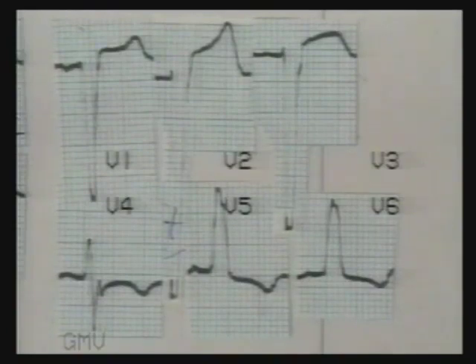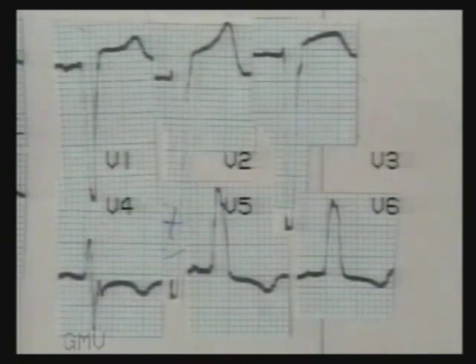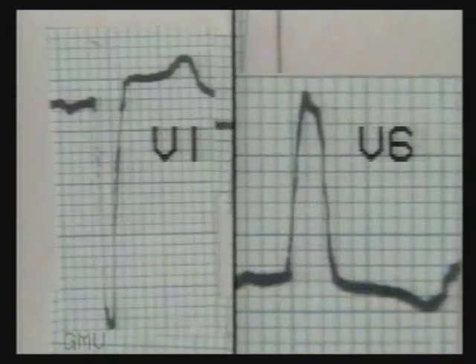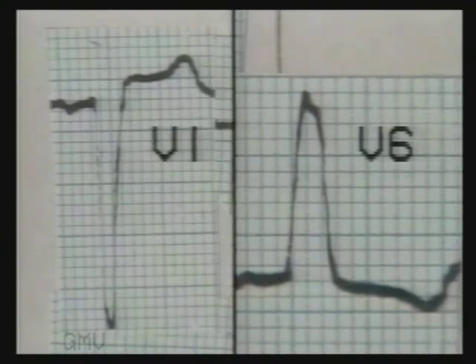This ECG shows wide QRS complexes. Lead V1 shows a broad and deep S-wave without an initial R-wave. Leads V5 and V6 show broad and slurred R-waves. So this is left bundle branch block. Note in close-up view the broad and deep S-wave in V1 and broad and slurred R-wave in V6, with the absence of a Q-wave in V6.